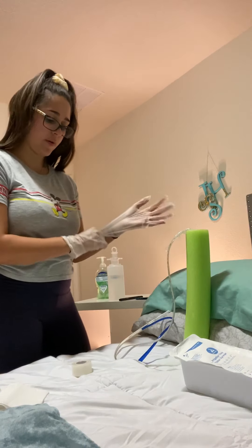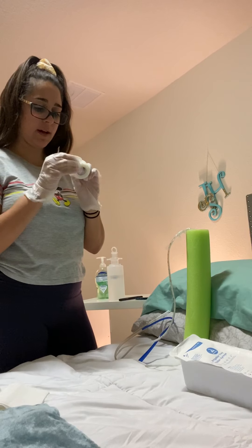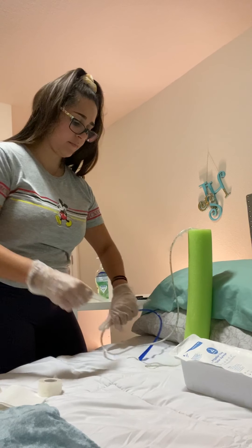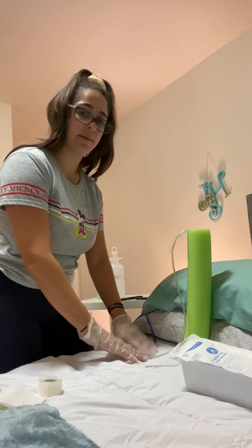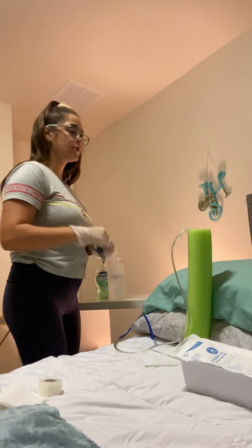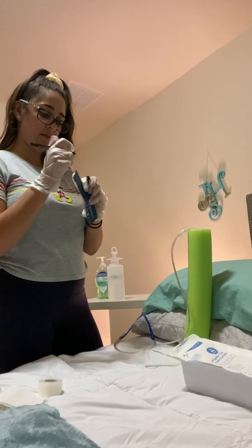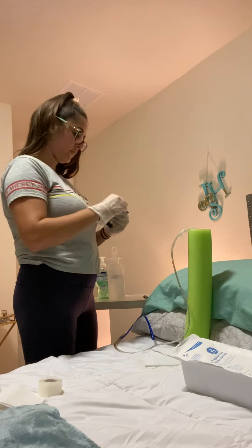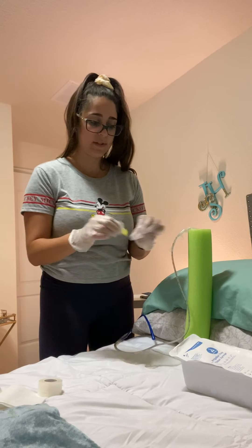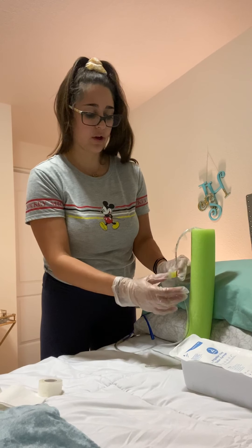I'm also going to tape the end of the tube to their gown. I'm going to label it with my initials, the time, and the date. Next I'm going to order an x-ray to verify that the NG tube did in fact make it to the stomach and not anywhere else, as misplacement could cause problems.